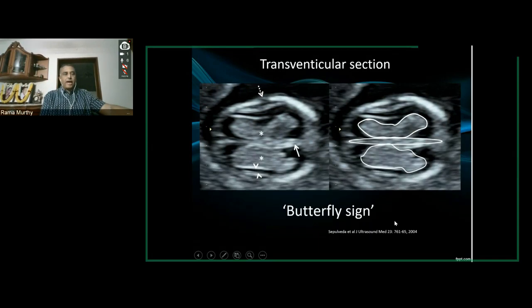Now, in addition to that, we must realize, yes, we are able to see the lateral wall of the lateral ventricle, that brilliant echogenic line there, a specular reflection that you see on one side and on the other side, and you will realize that the choroid plexus is contacting the lateral wall. That means it's like a tight plug. It doesn't look loose at all.